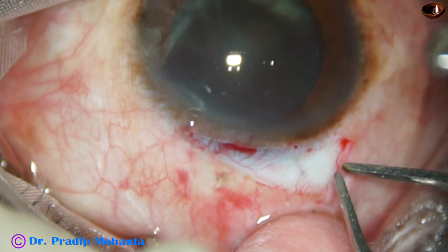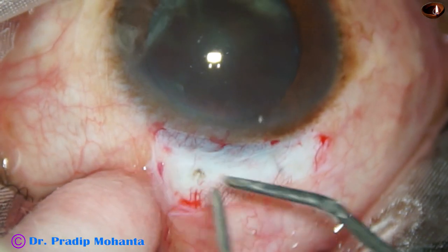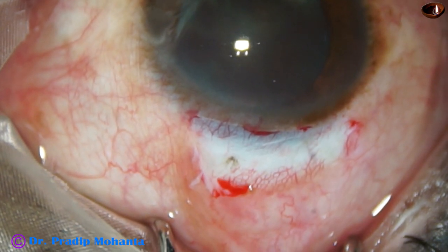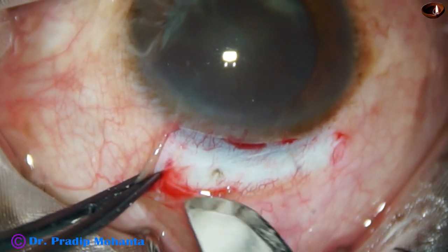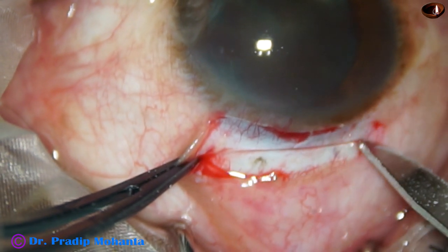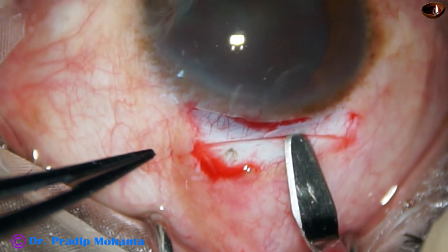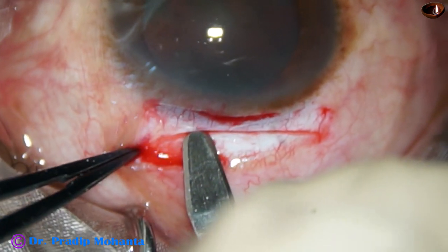Now the very important step: making the sclerocorneal tunnel. The incision has to be passed at about half-thickness depth of the sclera. This is a number 15 Bard-Parker blade, and it has been used to place the incision. This incision is not deep — about one-third thickness — and now the crescent blade is being used to go to the proper depth.